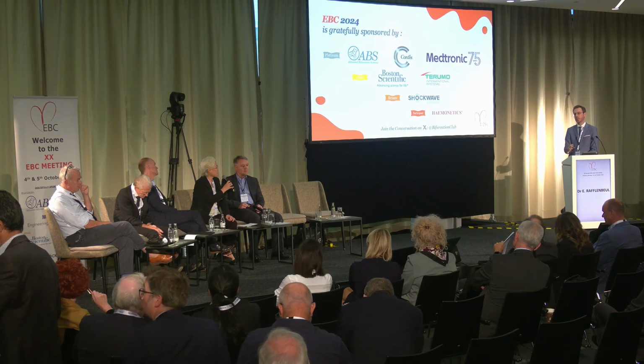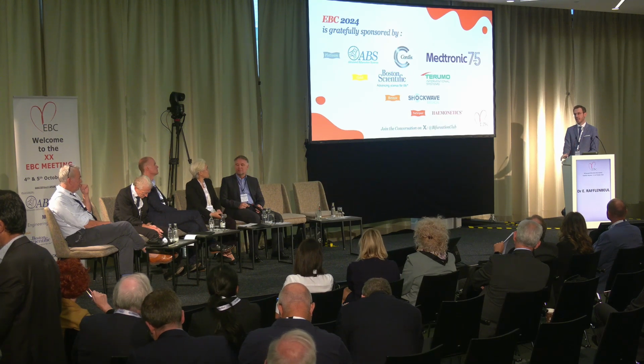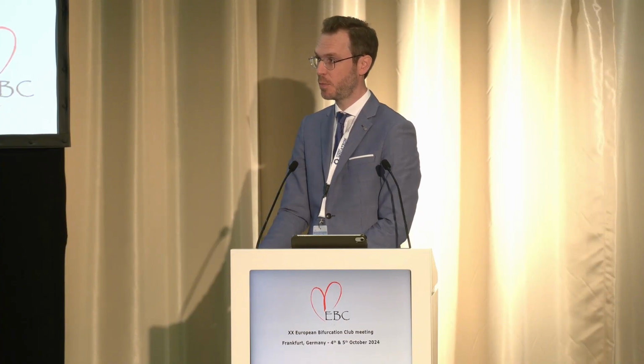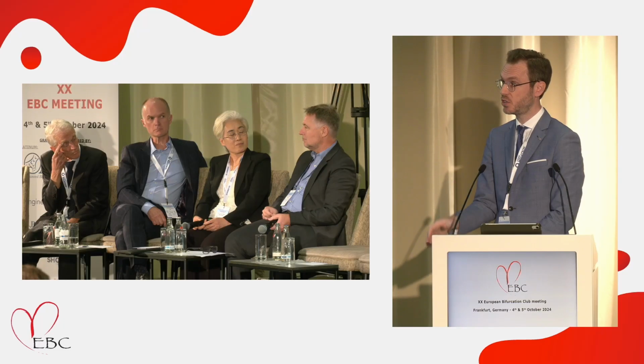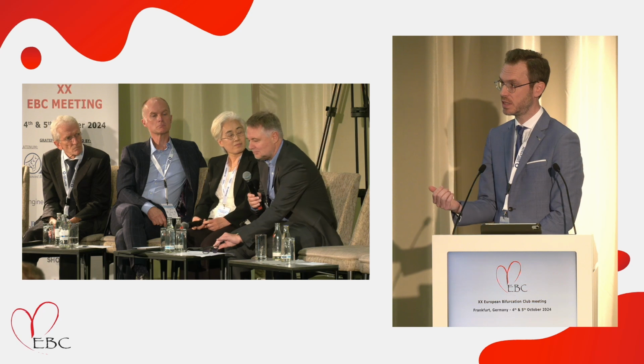So I'd like to know what is your bailout stenting rate in your... The reference diameter distal in the LAD was 4.3, and proximal to the bifurcation was about 5. So the DCB just touched, but the aim was to treat the lesion at the level of the bifurcation, distal to the bifurcation.